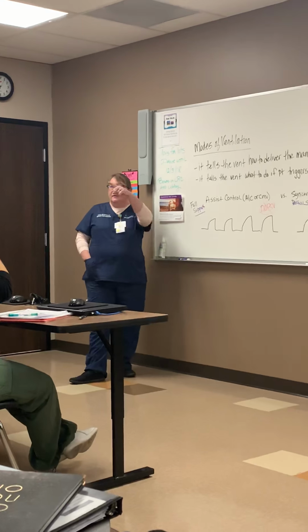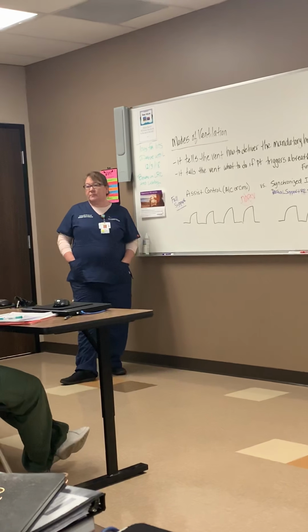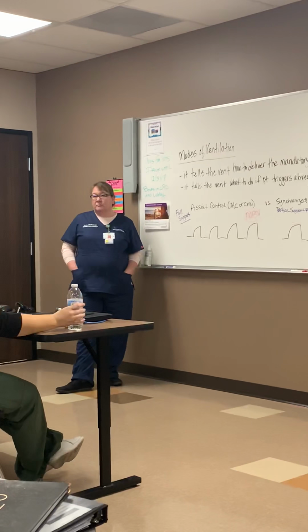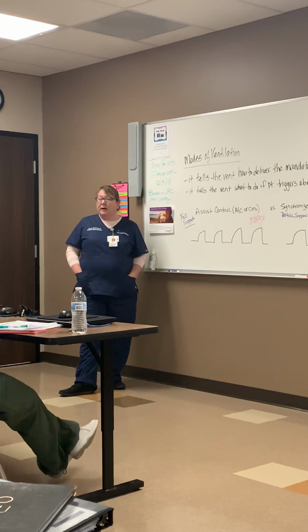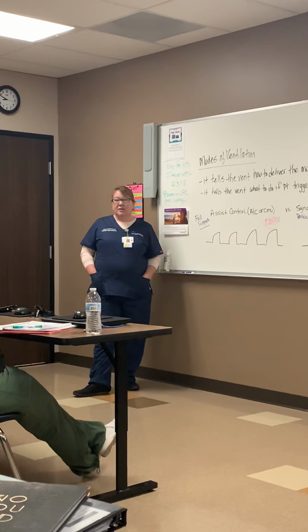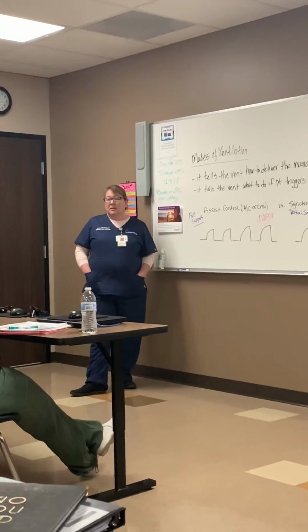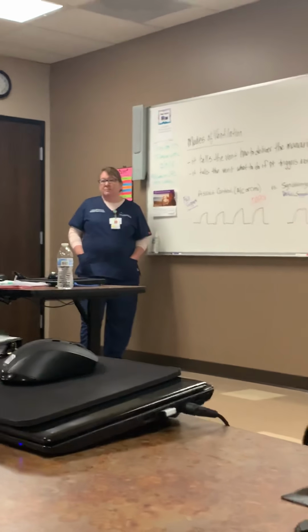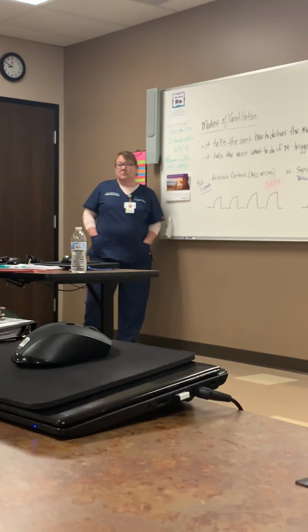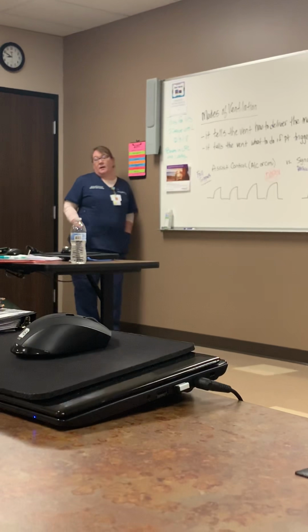Sure. Okay, Jeremy? So in assist control, if the patient is spontaneously breathing in, like a tidal volume of 100, will they be able to spontaneously breathe in their own breath, like you said, like those little red lines? Uh-huh, a small amount.